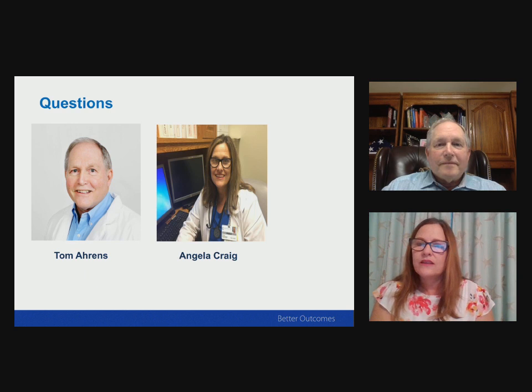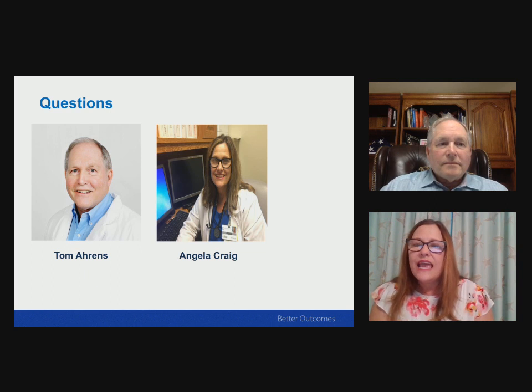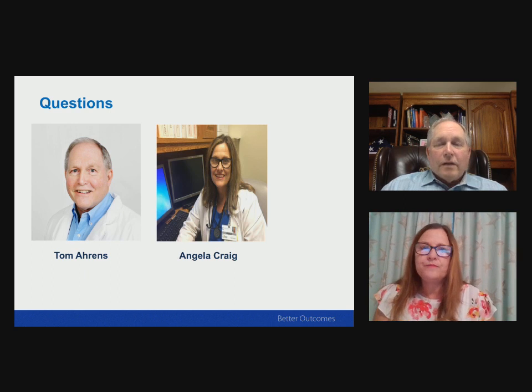Yes, excellent. Another question that has come up early in the presentation: you briefly mentioned end tidal CO2 with an asthmatic patient. How does that compare with patients with COPD? The principle is exactly the same. Now, if you have chronic lung disease, you're going to have naturally a larger dead space.